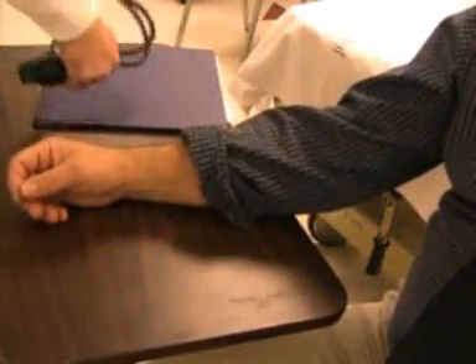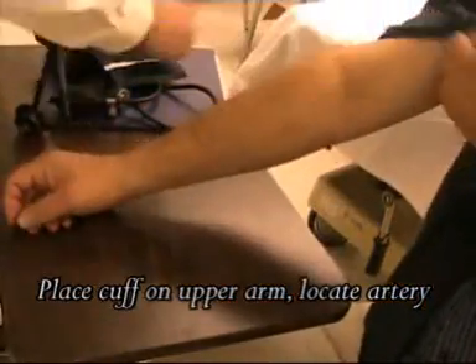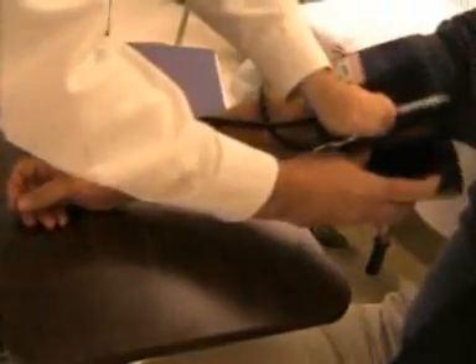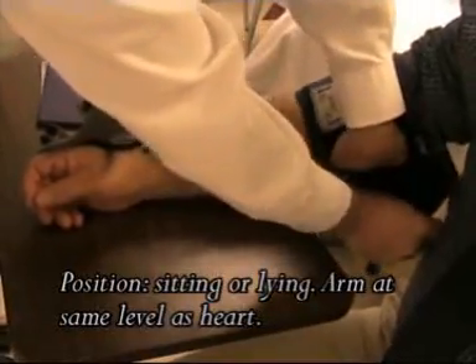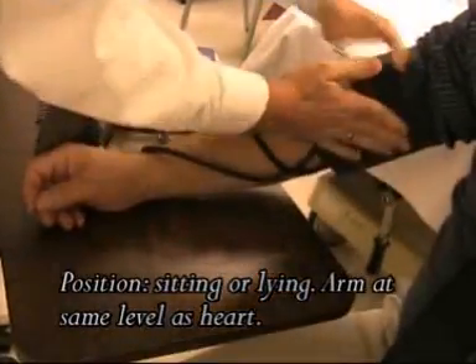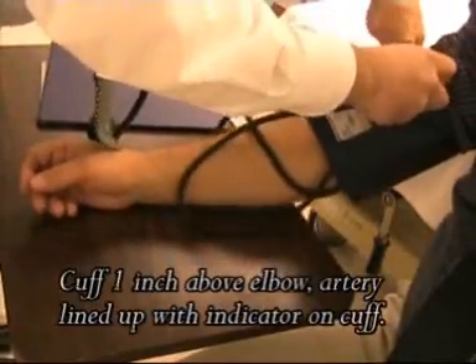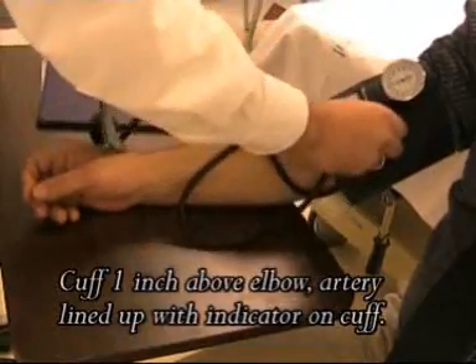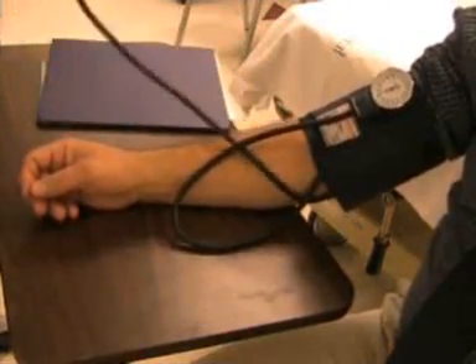Place the blood pressure cuff on the patient's arm. Roll the sleeve up and place the cuff around the arm. The patient should be sitting up or lying down with the arm stretched out and at the same level as the heart. The cuff should be about one inch above the elbow. Wrap the cuff snugly around. The blood pressure reading may not be accurate if the cuff is too loose.